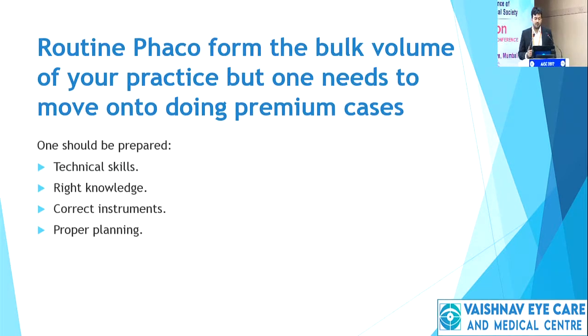As we know, routine phaco with monofocal IOL forms the bulk volume of our practice, but we need to shift gears and move on to doing premium cases, provided we are prepared with the right technical skills, the right amount of knowledge, the correct instrumentation, and proper planning for each and every case.